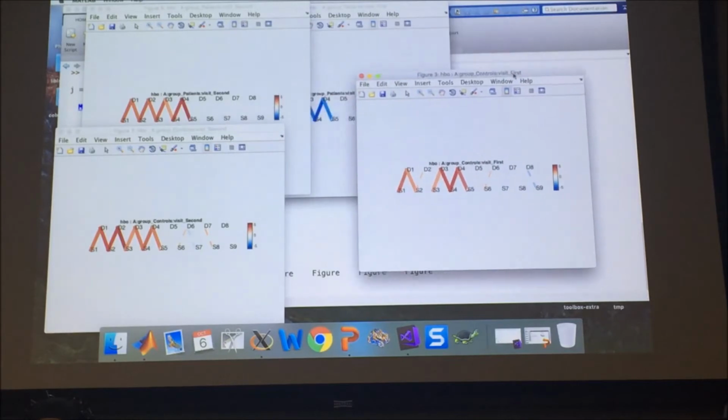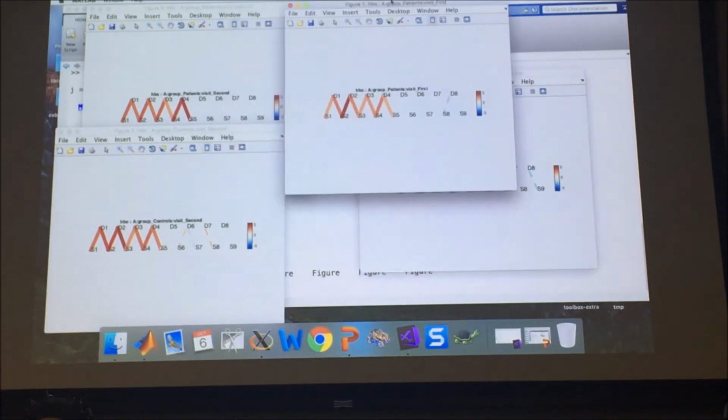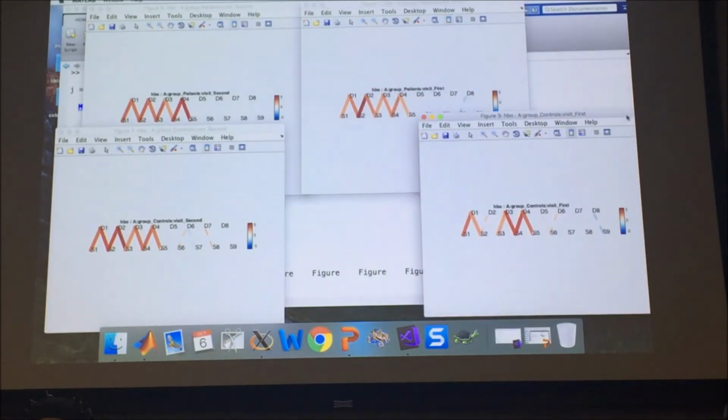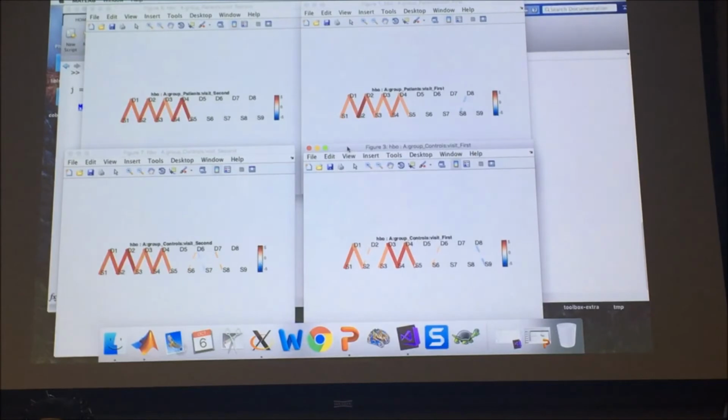Now what I did was I had basically demo data that had the same task in every one of the subjects. So I kind of fictitiously added groups and sessions on for the purposes here. Hopefully, I didn't actually look this morning, but if I statistically test group 1 versus group 2, I shouldn't find a difference because they came from the same subject pool.